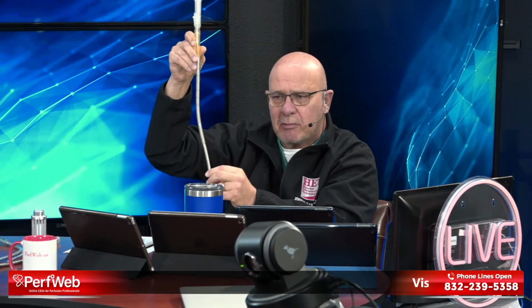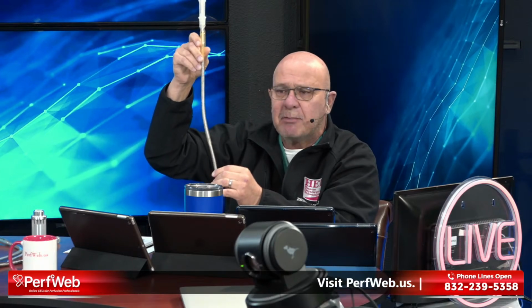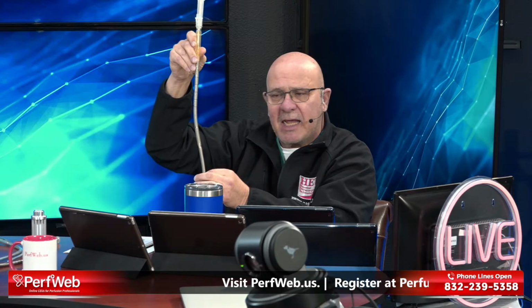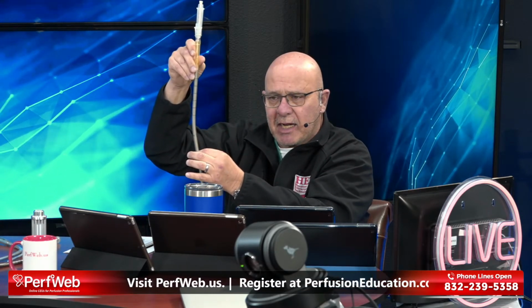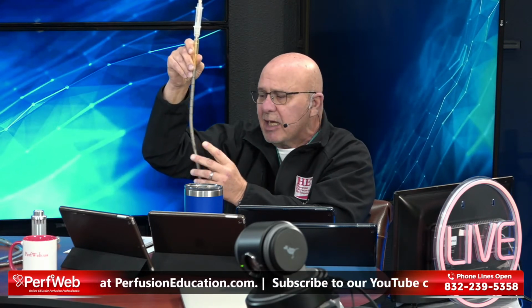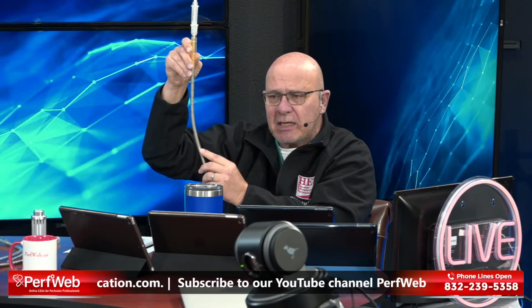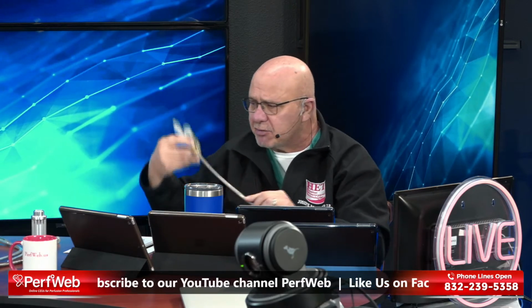It has to be put in the right configuration, the right depth, not too deep, not too shallow, in order for the holes to be where you want them to be. Access in the IVC and the SVC, return in the right atrium. Generally speaking, it should be positioned so that the outlet, the exit port, is directed towards the tricuspid valve. It reduces recirculation and maximizes the efficiency of your VV ECMO strategy.